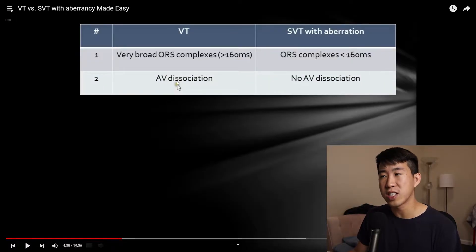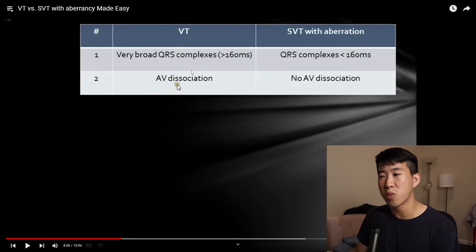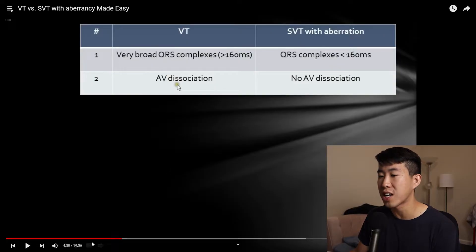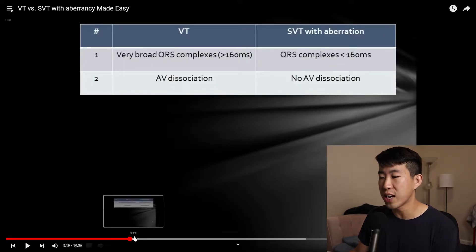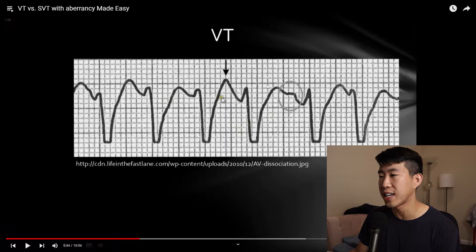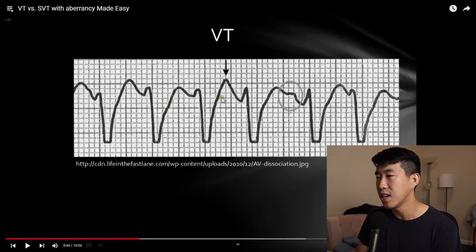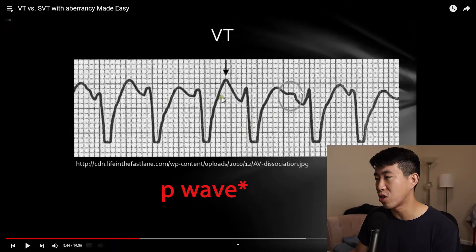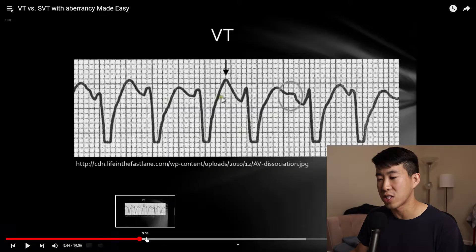The next thing to look for in VT is AV dissociation, which is almost pathognomonic for VT — highly specific — whereas SVT with aberration will not show AV dissociation. For AV dissociation, you're looking for P waves marching along with no correlation to the QRS complexes. You can see here there's a P wave embedded in this area, and then another P wave in a different spot, showing that there is AV dissociation.